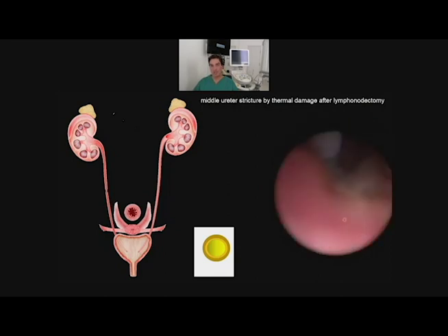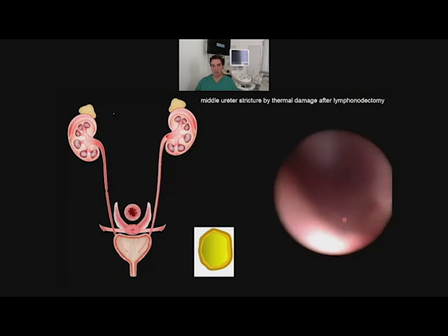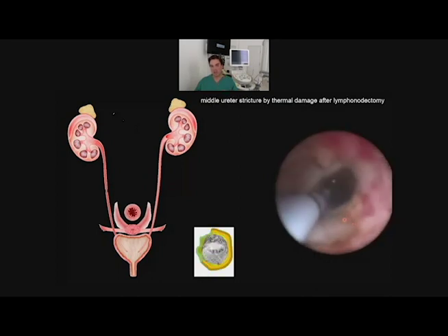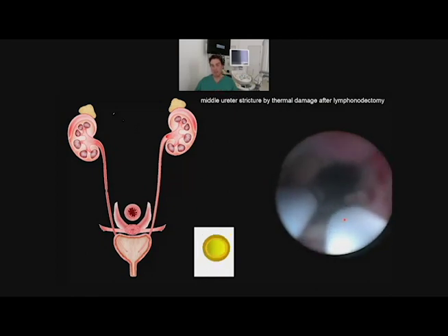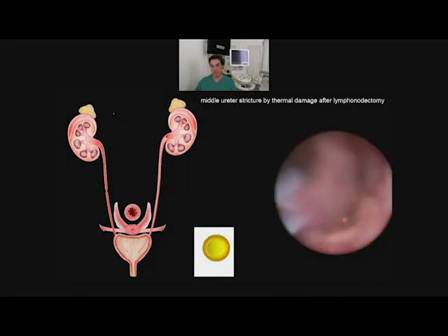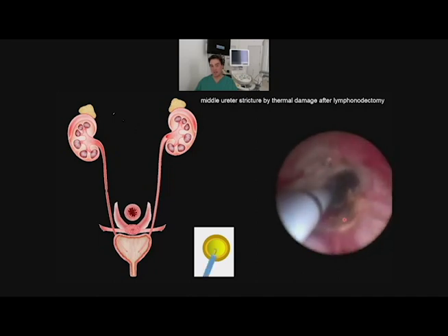I cut the stenosis. And what you see here now, I have no problems, also with small bleedings, because monopolar can also coagulate. But I don't want to make more scar. It is important that you cut the stenosis, the stricture, really properly. And if you cut it, then it's like a fistula or like the bridging you saw before. If you put a stent across the part where the stricture is totally cut, then the ureter will be replaced in a normal way and we can bring the stent out 3 months later and all is okay.